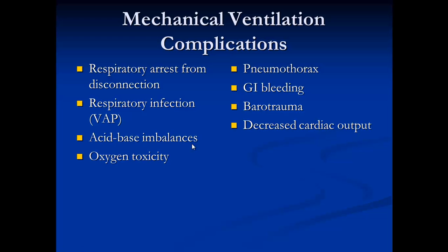Remember your complications: disconnection, ventilator-associated pneumonia, the acid-base imbalance that the patients could have being on the ventilator, oxygen toxicity. Don't keep the patient on a high FiO2 if it's not necessary. Pneumothoraxes, Curling ulcers and GI bleeds, barotrauma, and remember your PEEP decreases cardiac output.